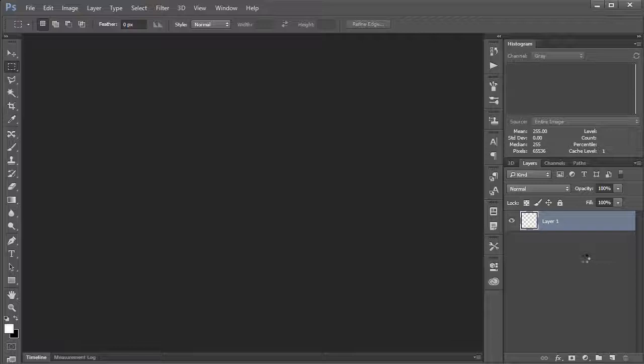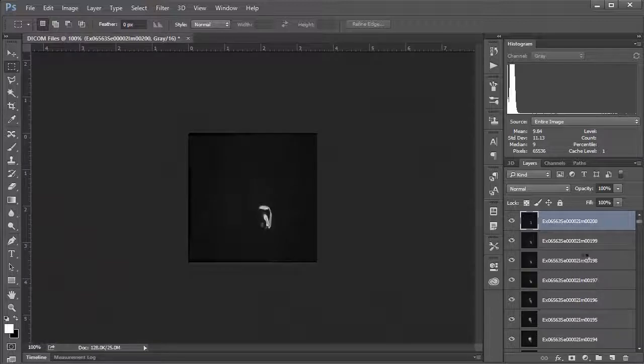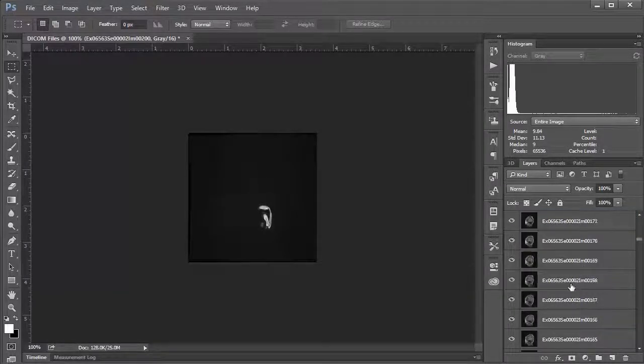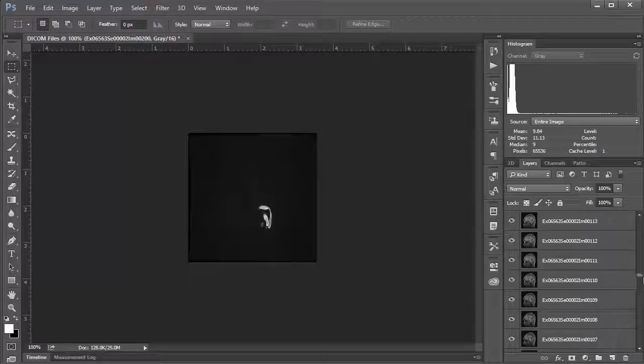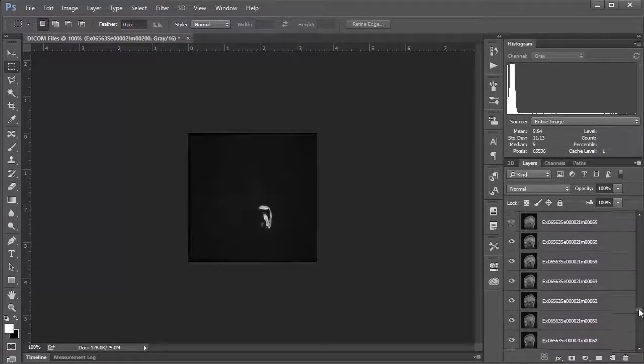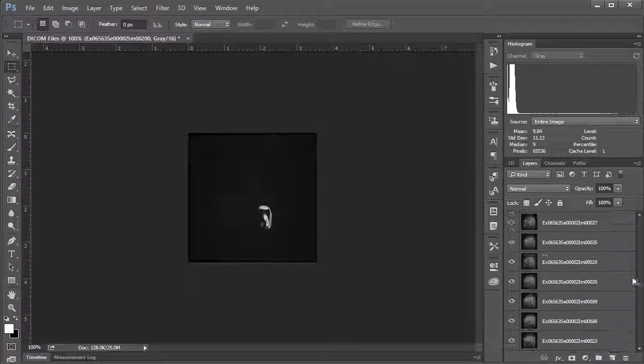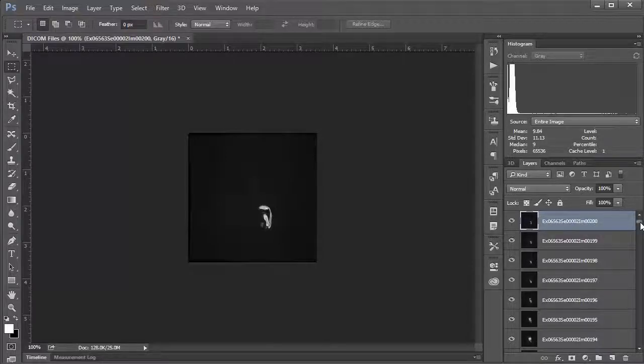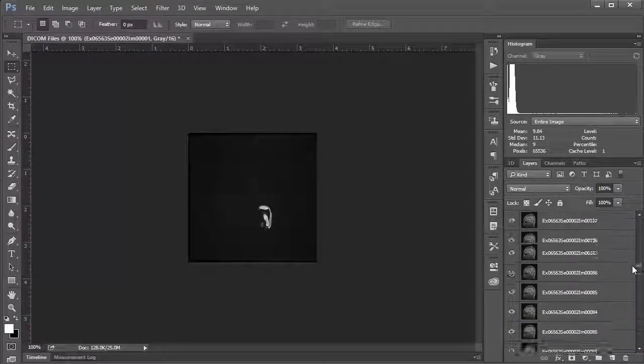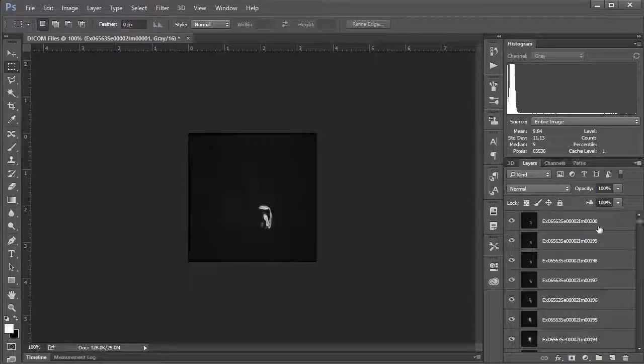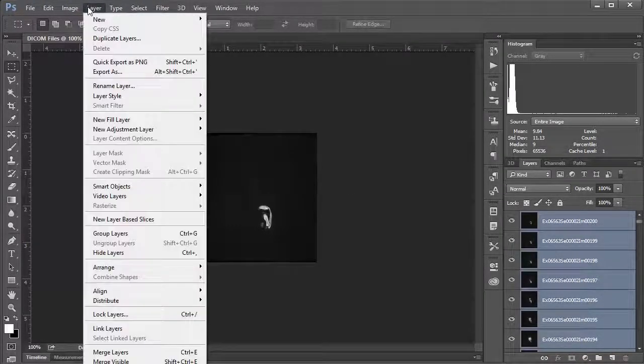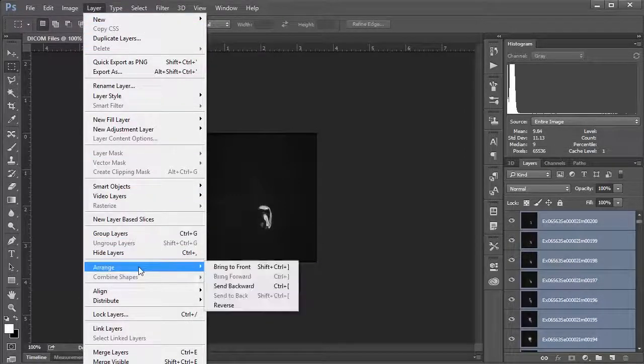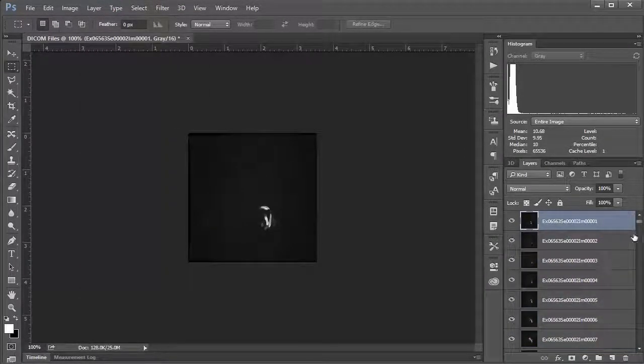You can see here we've got a whole bunch of layers at different levels of the brain. This is not my brain, this is a brain of somebody else—not that it really matters. We've got image number 200 up here and number one on the bottom, so they've imported in reverse order. I'm gonna switch them around. I'm gonna select the bottom layer, scroll up to the top, hold Shift and select the top layer, and then go to Layer, Arrange, and Reverse.